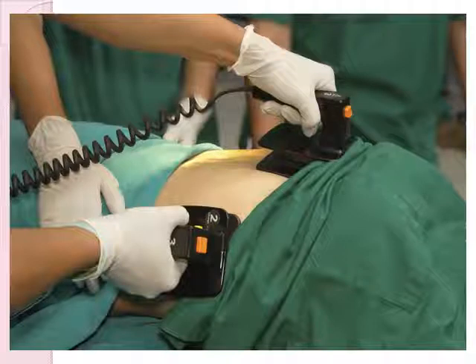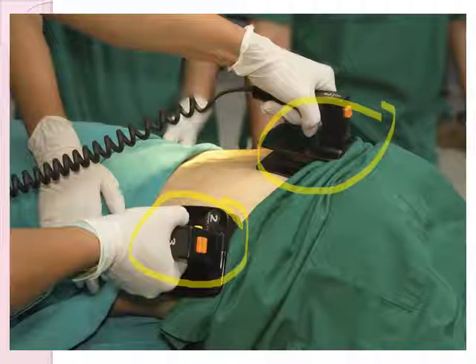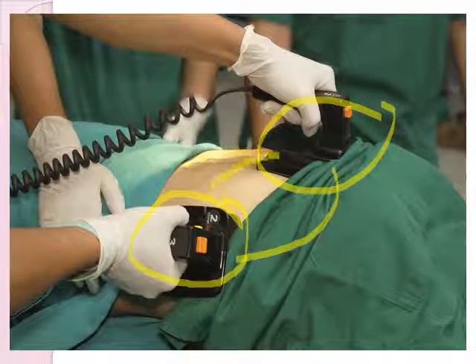Take note of the placement of the pads. Okay, so one of the electric pads is placed on the right upper chest of the patient and then another one on the left lower chest of the patient. So this corresponds to the apex and the base of the heart. So here, this is where your apex is. This is where the base of your heart is. So the purpose of this placement is to allow for the electrical impulses to travel throughout the heart.